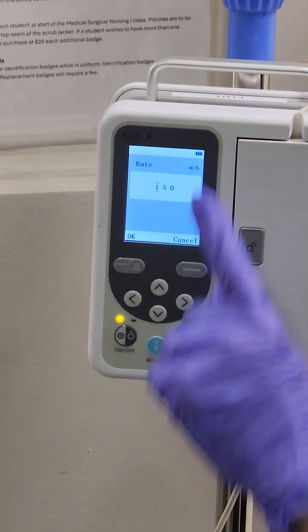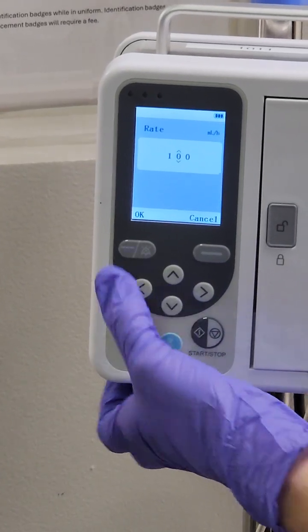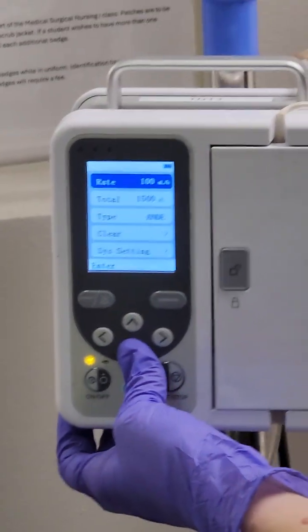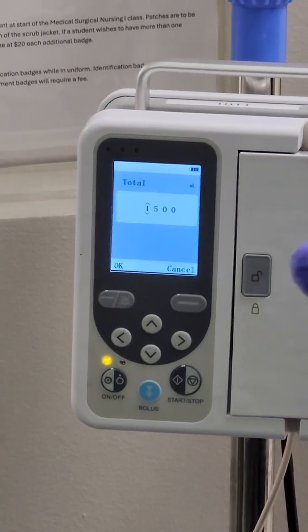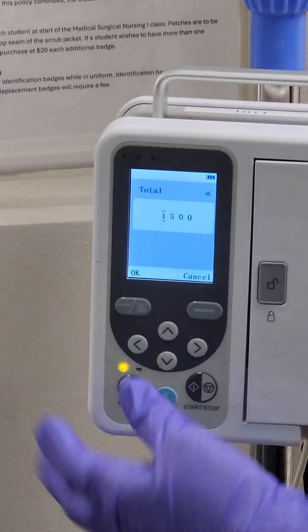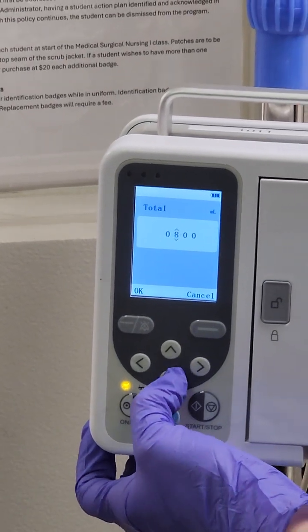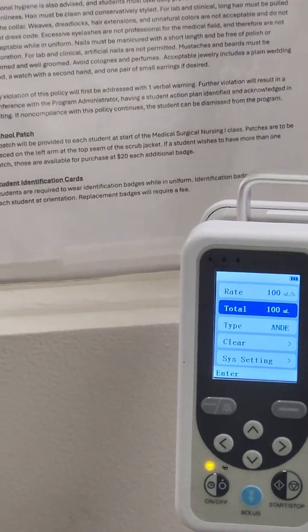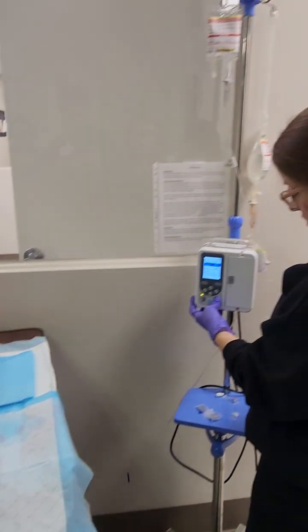I'm going to hit this, and I've got it at 150, but I need to change it to 100. So I've changed it and it says milliliters per hour. Then I'm going to go down, and this is where I put my volume in. So how much is in my bag? 100. The previous volume was 1500, so I'm going to change this to 100, okay. Make sure everything is unclamped, and then I'm going to hit start.